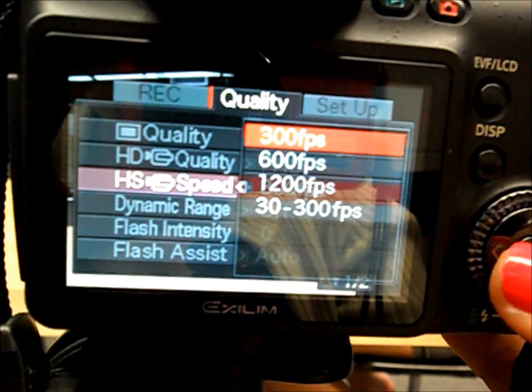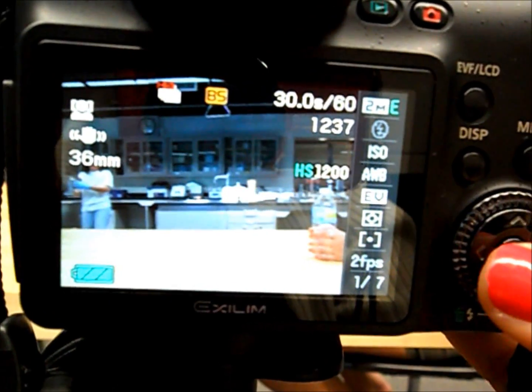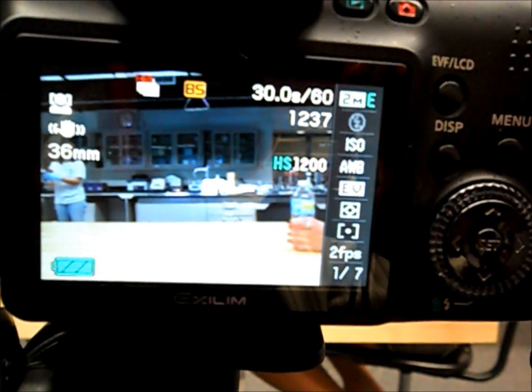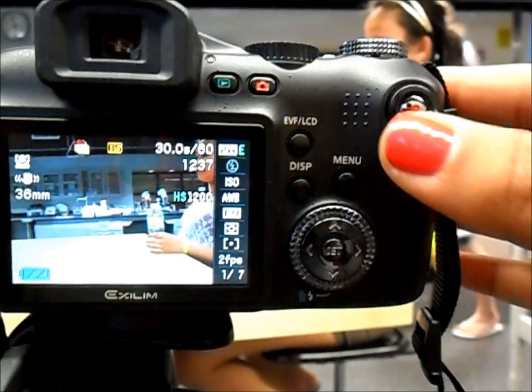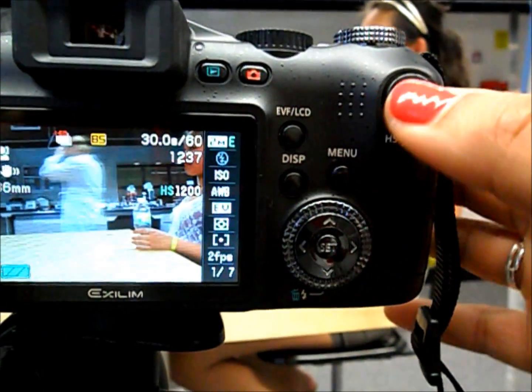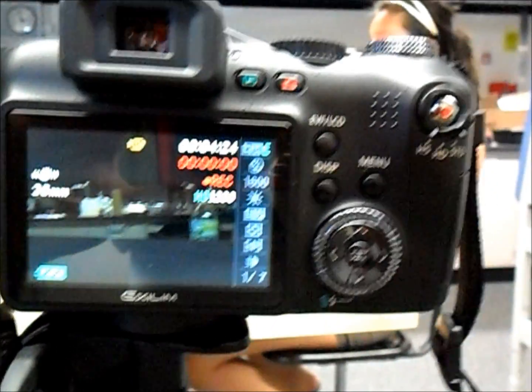Go down to high speed and you can choose the frames per second that you want. You can do either 300, 600, or 1200. 1200 is the most. Then you can go ahead and press record, which is the red button, and then record your test subject doing the reach and grasp cycle, which we will discuss later.